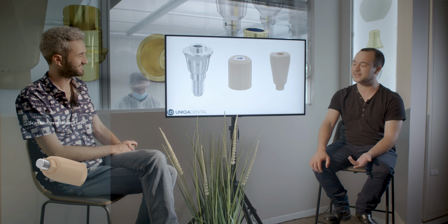If you take impressions on implant level, you know the exact position of the implant. And with implant level scan abutments, you can choose from all the parts. I'll show you a little bit more in the next slides.